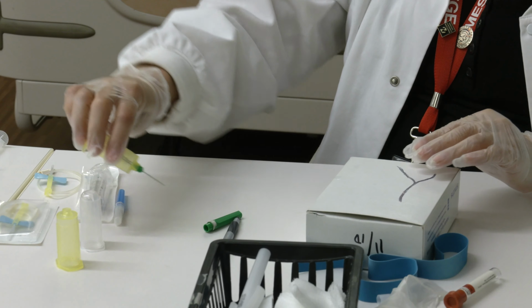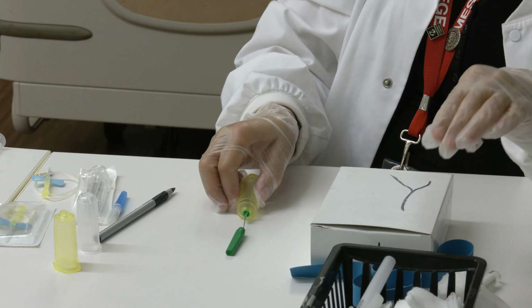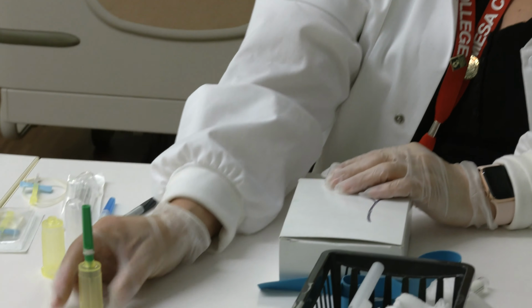All right, again, safety is always first. You do not take up a cap and you don't recap. You always scoop. So we're going to scoop, and then we'll be able to safely recap.